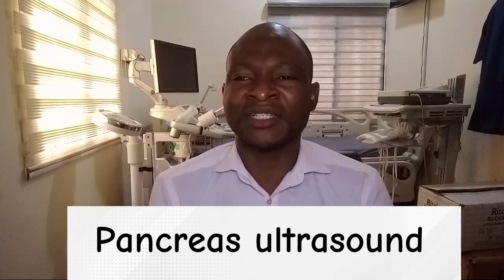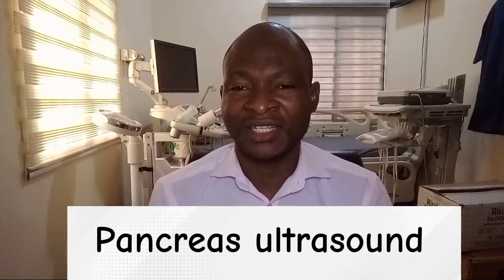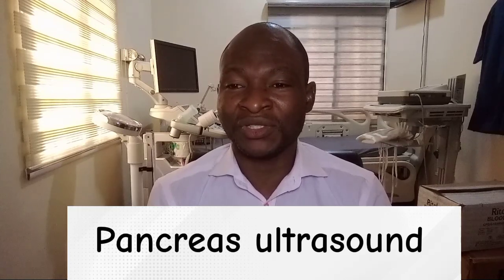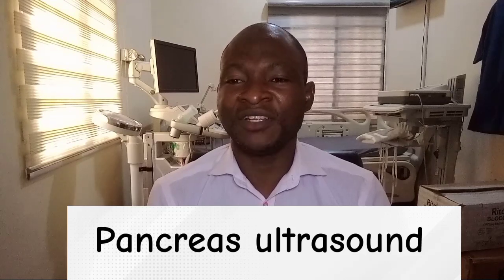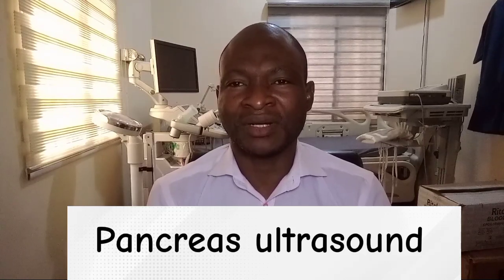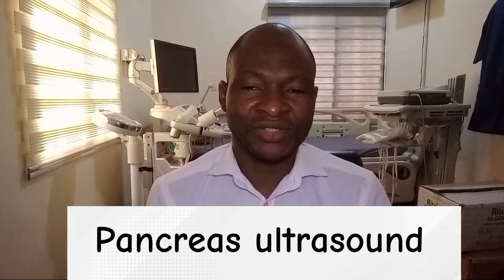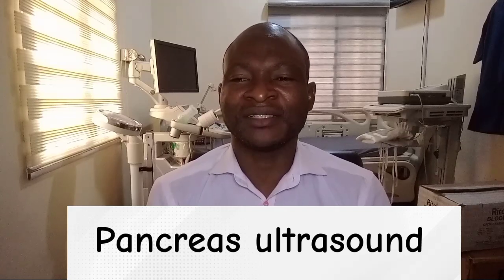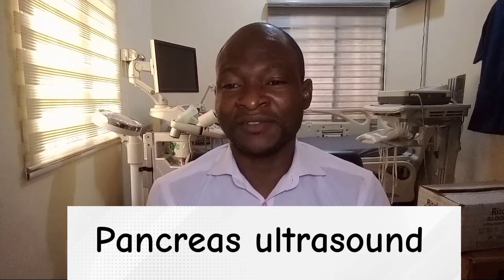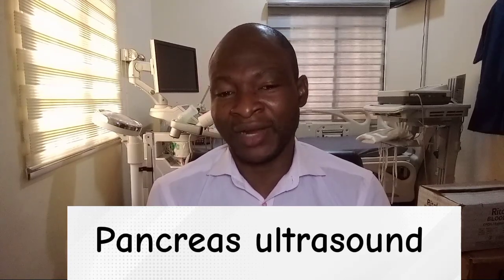In children, the pancreas may be significantly larger than the normal adult measurement, whereas in elderly, it may be reduced to a thin strip of tissue which is heavily fibrosed with a mildly dilated main pancreatic duct. Hence, in children, the pancreas is less echogenic than in the elderly, since fibrous pancreas is highly echogenic, right?